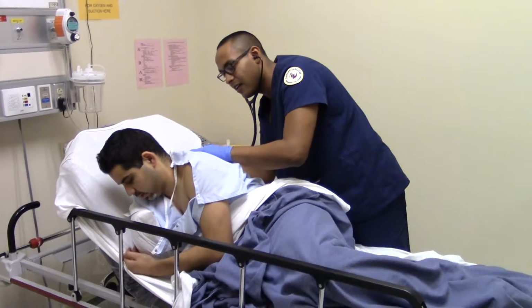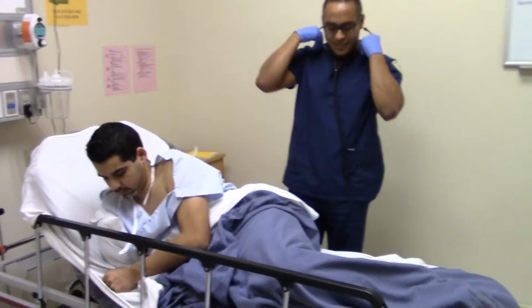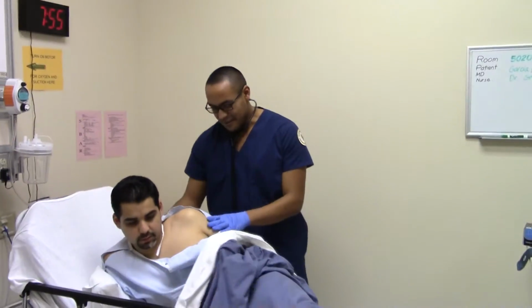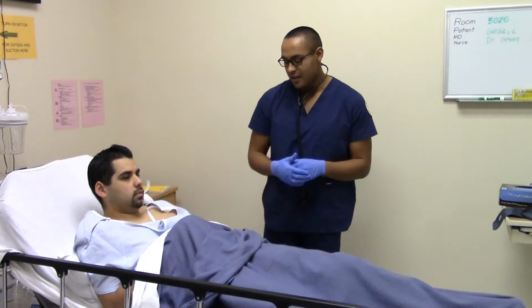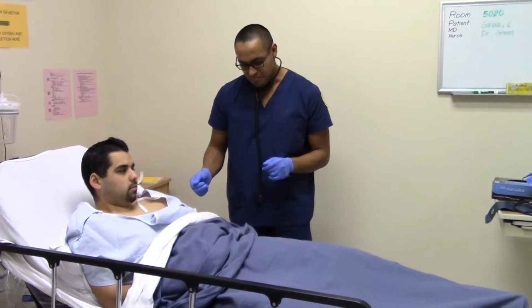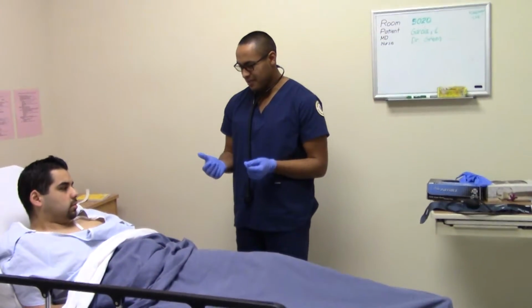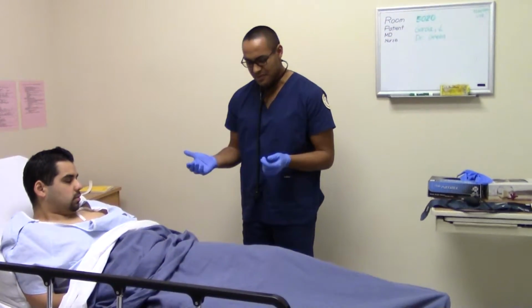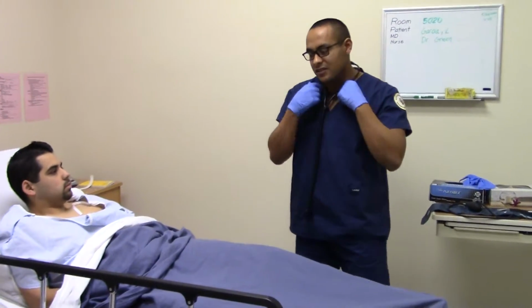Sounds good. It's looking good. Guess what? Your wheezing went away. So that's good. It worked. Okay. I'm going to go ahead and get another set of vital signs to see where you're at.